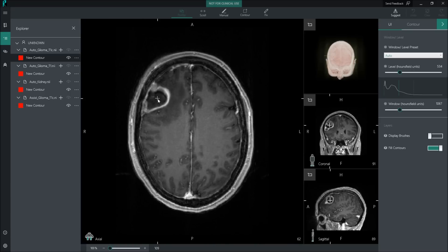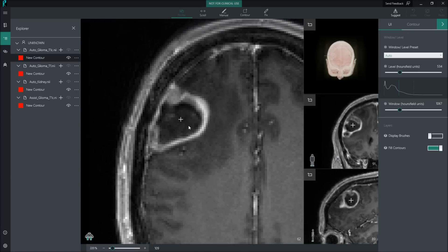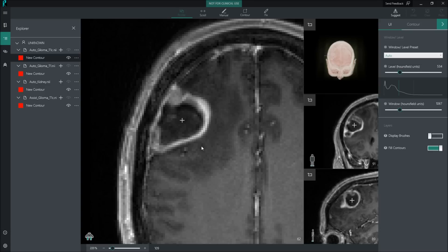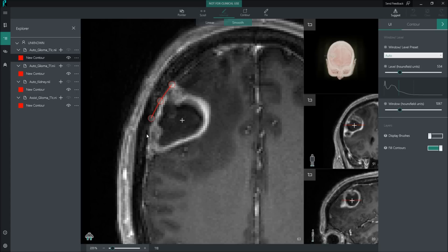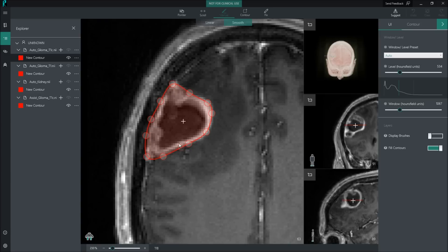The patient needs to be treated with radiotherapy, but before doing so, Raj needs to prepare the data. Raj normally does so by using a click-based tool, such as the one I'm using here, to outline the tumour. This outlining operation needs to be done in 3D, so it needs to be repeated for each of multiple dozens of horizontal slices wherever the tumour is visible. This manual operation is inaccurate, time-consuming, and expensive.